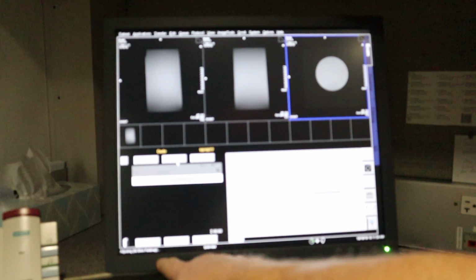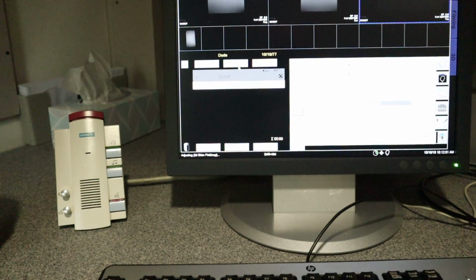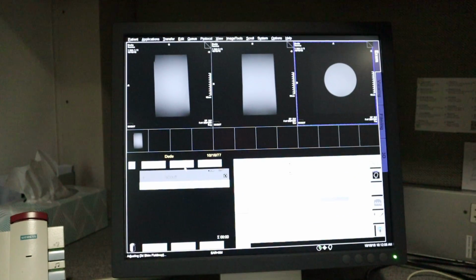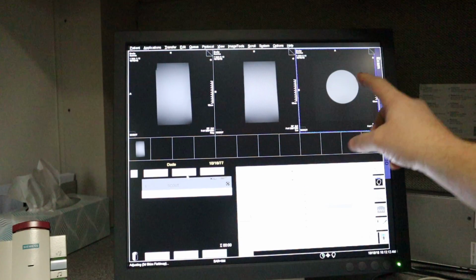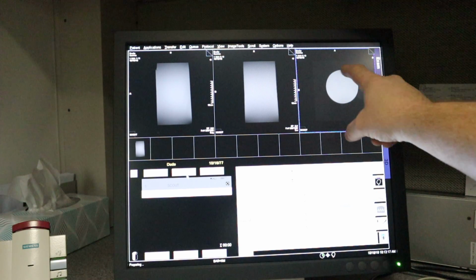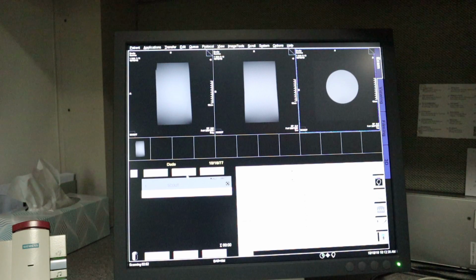And so if you look in the corner down here, it'll say adjusting 3D shim field map. And so what does that do for us? And again, I'm sorry about the camera if it's not focusing here. What that's doing is that green box is actually creating a phantom shim, so to speak, over the image. And so now when it scans, the volume will be adjusted tighter instead of larger.